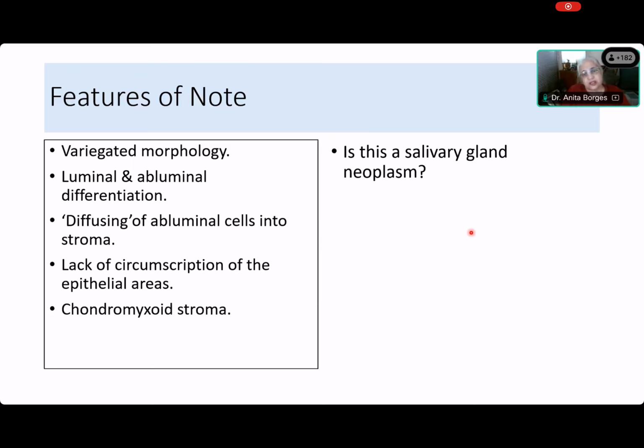Okay. So the answer to this question, is this a salivary gland neoplasm, is yes. But why is the answer yes? Because it has all of the features that we would expect in a salivary gland neoplasm and none of the features that we would expect if this came from something surrounding the salivary gland. It's not a lymphoma. That's why I was very interested in Shivani saying I can see lymphocytes. So it's not a lymphoma. It is not something metastatic to the salivary gland. So this is very likely, in fact, a salivary gland neoplasm. And we need to ask this question because sometimes you may mistake something in the deep lobe or close to the deep lobe of the parotid for a salivary gland neoplasm.